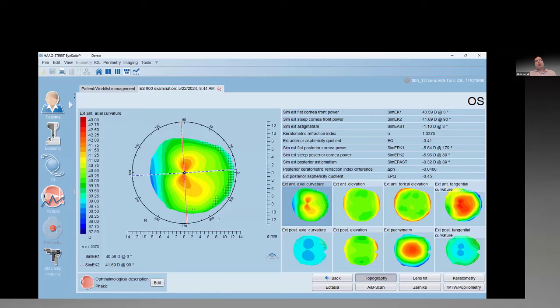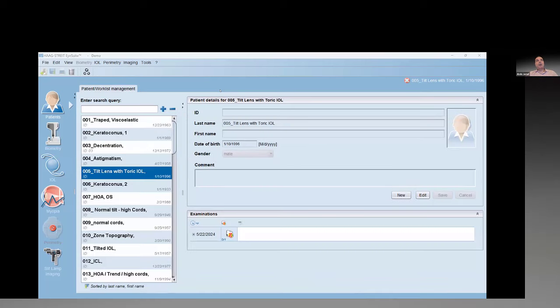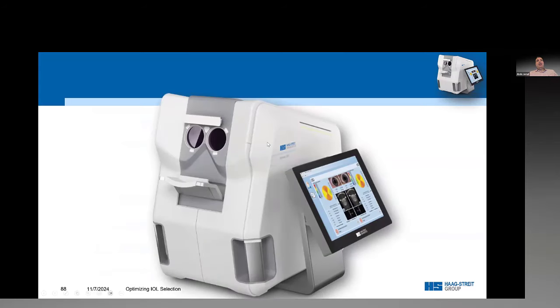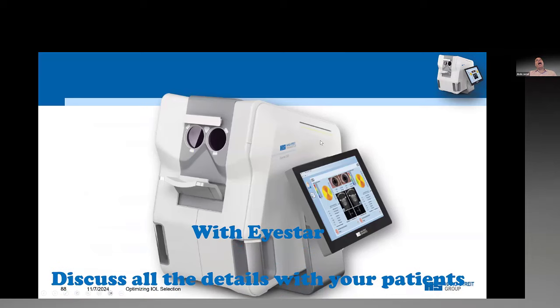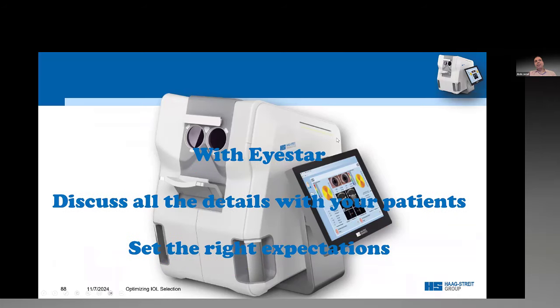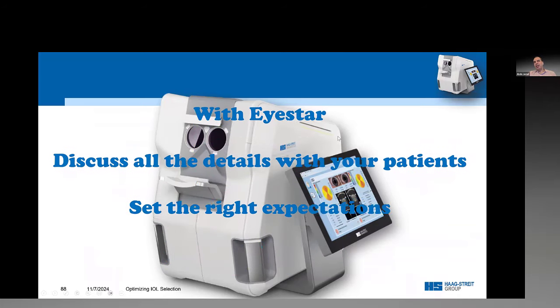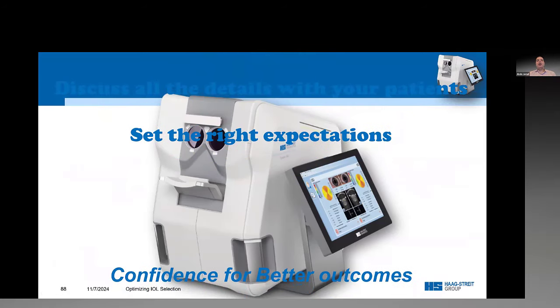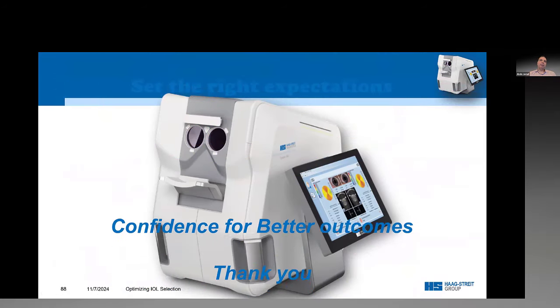So these are more or less the cases that I would like to show. So with Eyestar, you can discuss all the details with your patients, set the right expectation, and you have confidence for better outcomes.